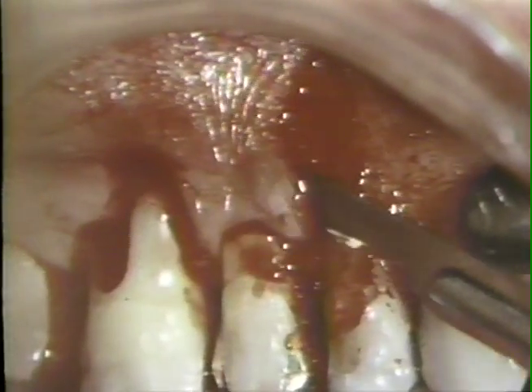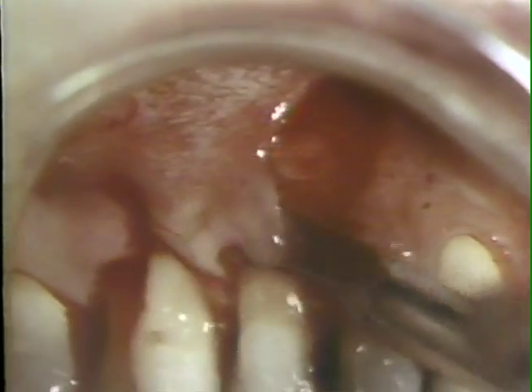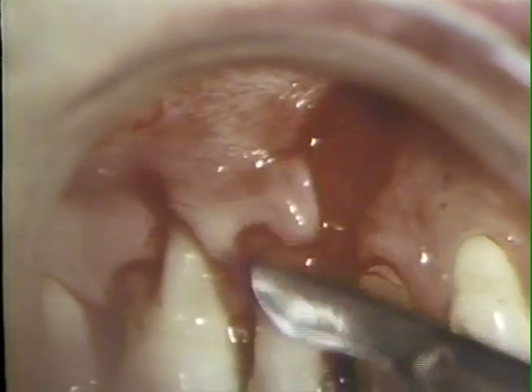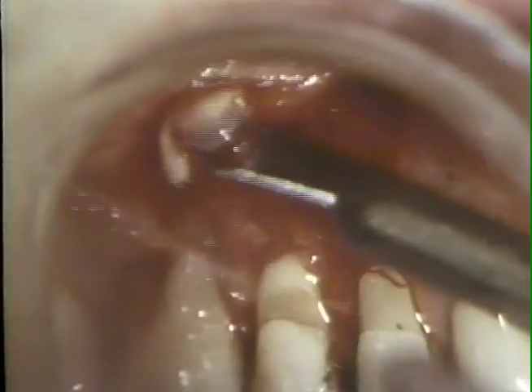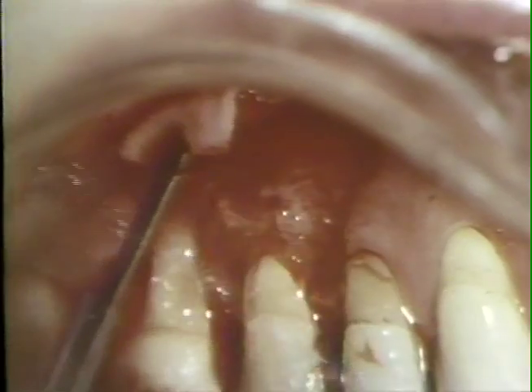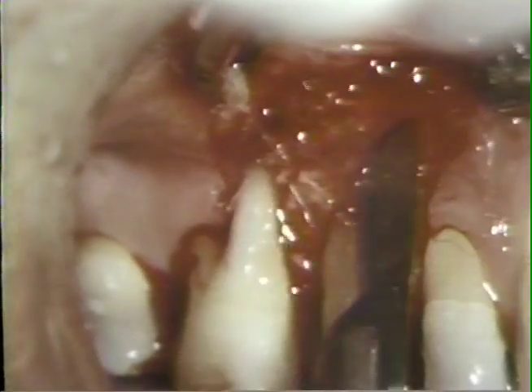A partial or split thickness dissection is carried out in order to leave periosteum at the donor site. This will ensure that no unnecessary exposure of the underlying bone will occur. The flap is released from its underlying attachment. Note the absence of any exposure of bone on the second premolar. Soft tissue covers the underlying alveolar process. The muscle fibers are severed at this time to permit more mobility and facilitate the positioning of the flap.